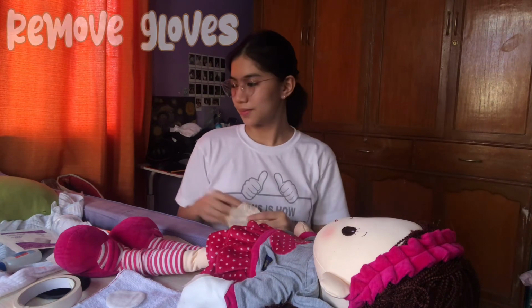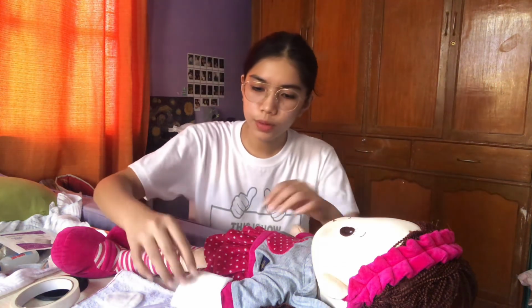We will remove the gloves. Label the dressing and secure the IV tubing. So we will place the date and the time of the dressing change and the initials either on the label provided or directly on the tape of the dressing.